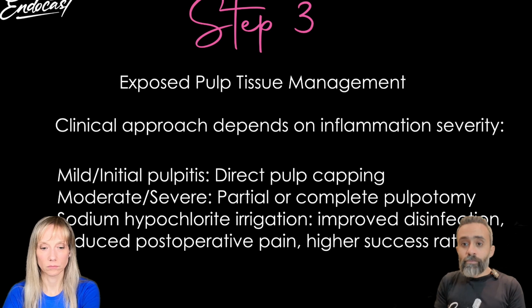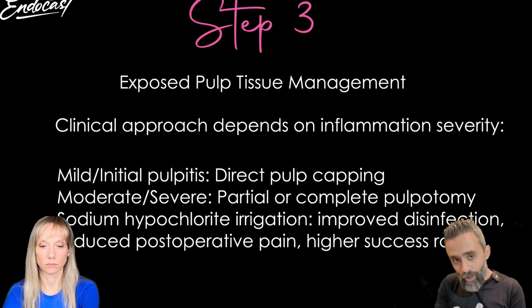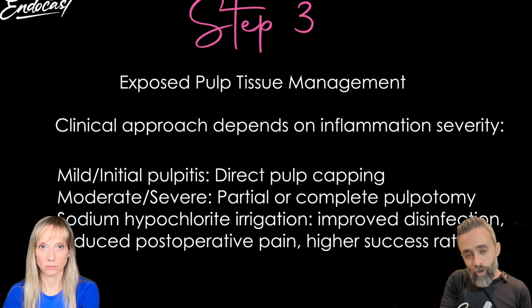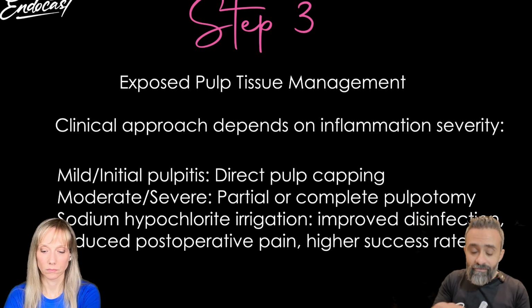And then you perform your hemostasis, whether with a sterile cotton pellet soaked with saline and press for some time, or with low concentration sodium hypochlorite soaked in a cotton pellet and pressed for 5 minutes, for example, or a passive flush of high concentration sodium hypochlorite for a couple of minutes until you disinfect and stop any bleeding.